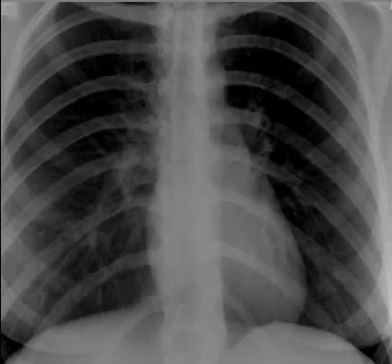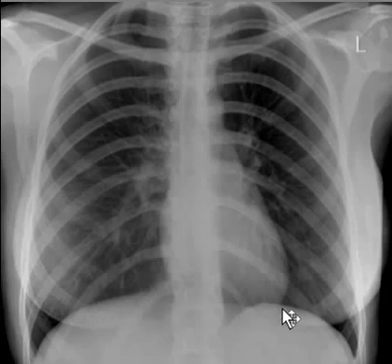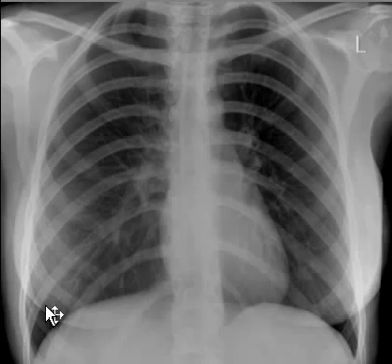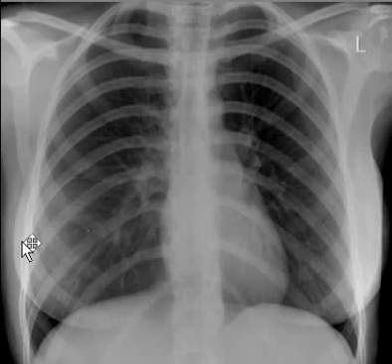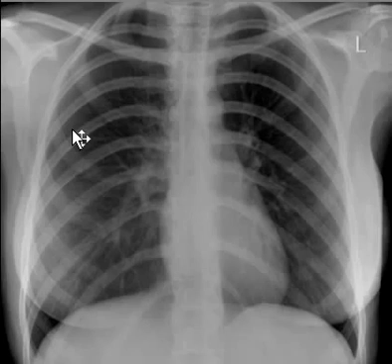This turns out to be an absolutely normal X-ray. You can also tell this is a female patient because of the presence of both breast shadows. Notice there is a subtle difference in the densities of the lower lungs — this area looks darker because the breast absorbs some of the radiation, decreasing the density of the lung underneath the breast. X-ray used with permission, courtesy of Dr. Alex McLennan from the UK. Thank you.